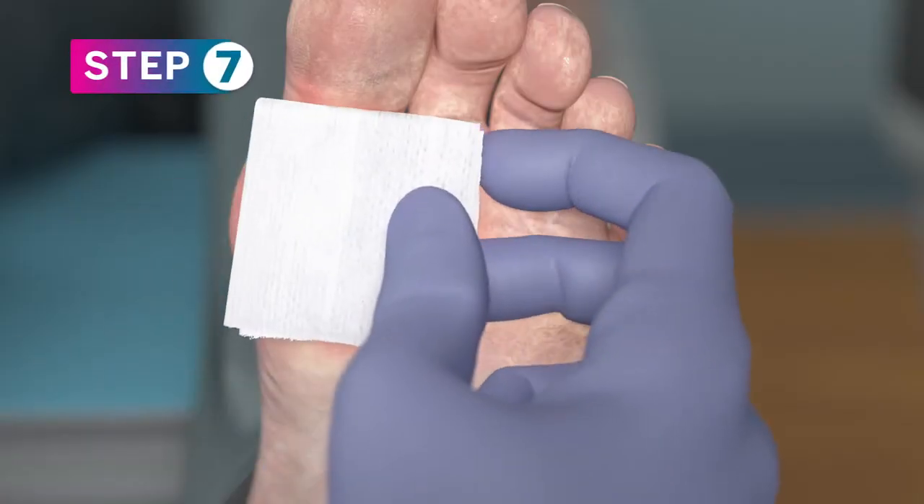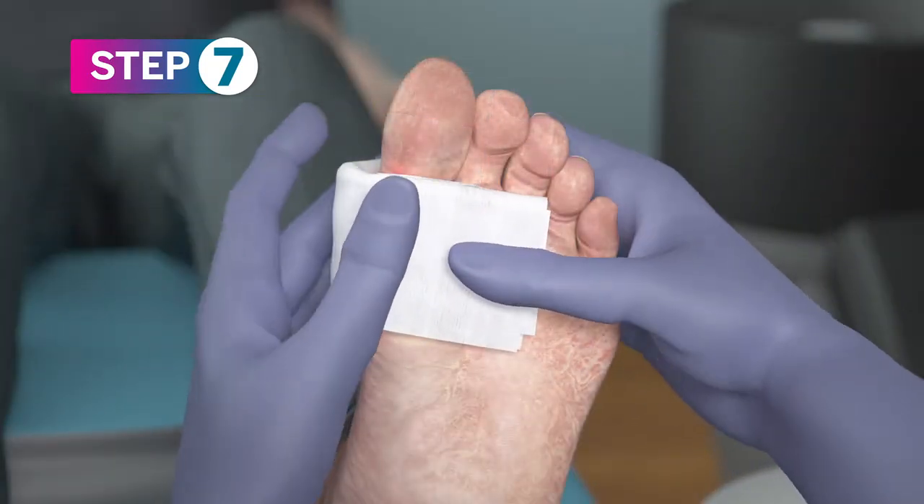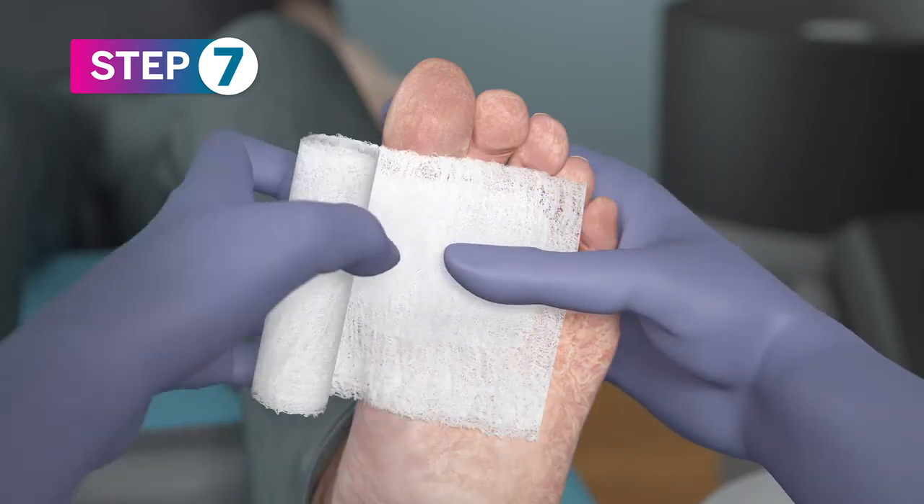Cover and wrap the wound with gauze. PurePly AM can be applied from the onset and for the duration of the wound. Reapply weekly as needed.